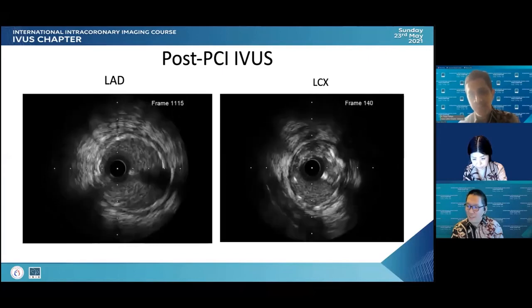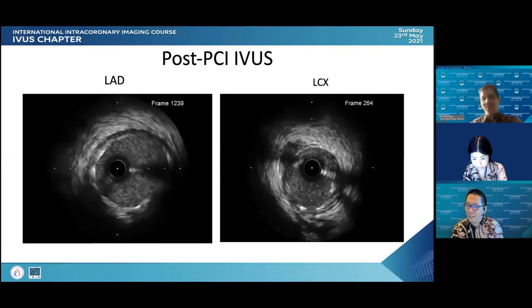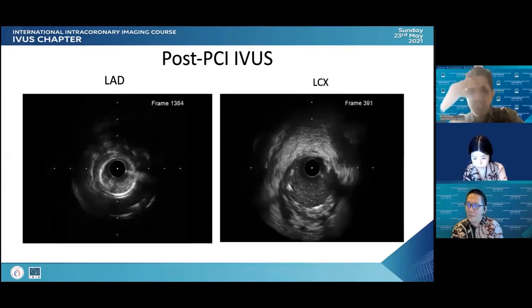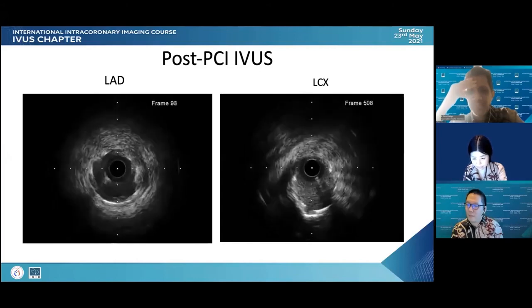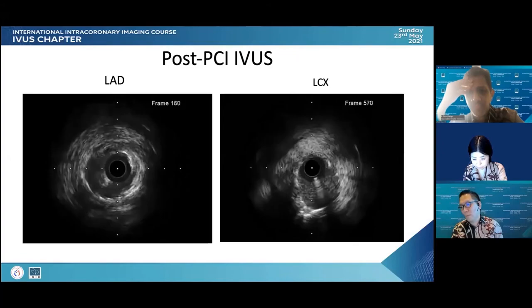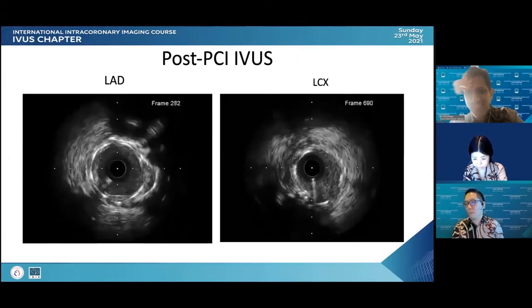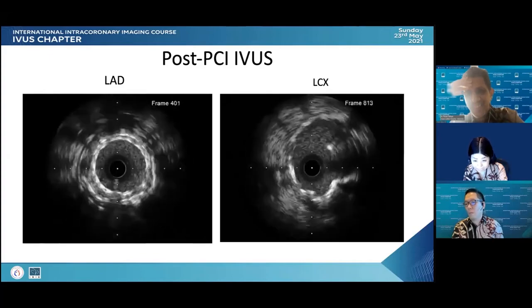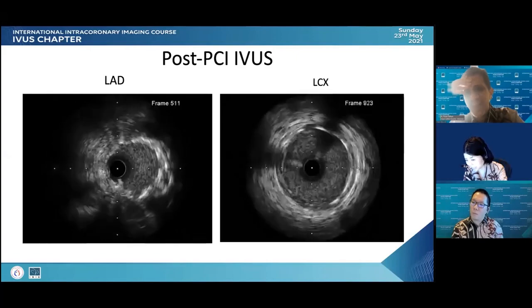So starting the non-stent segment, which is the distal segment, and now you see the stent, there is no edge dissection, that's good. And actually the landing is really good, meaning you didn't leave some disease, right? And then we are coming to the proximal, and there is a calcified eccentric calcium at nine o'clock, but I'd say okay. And you see the ostium of the circumflex.